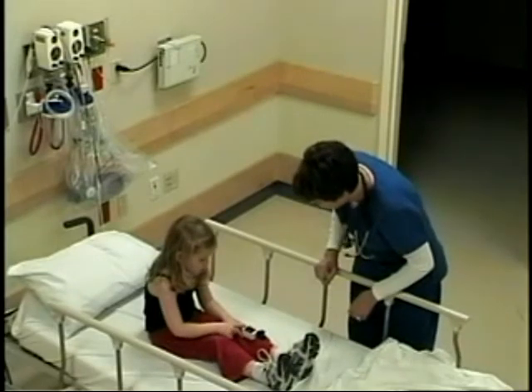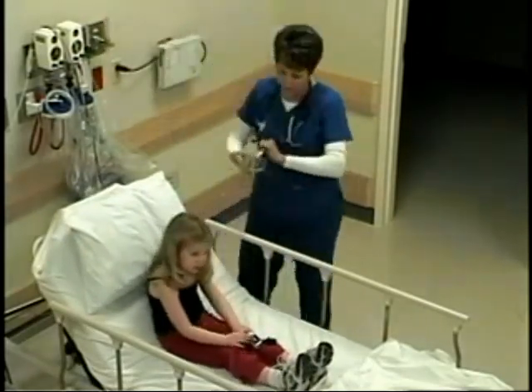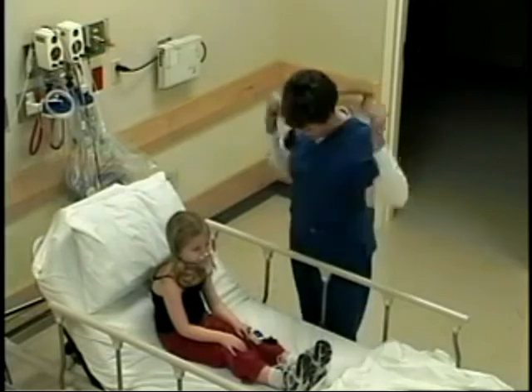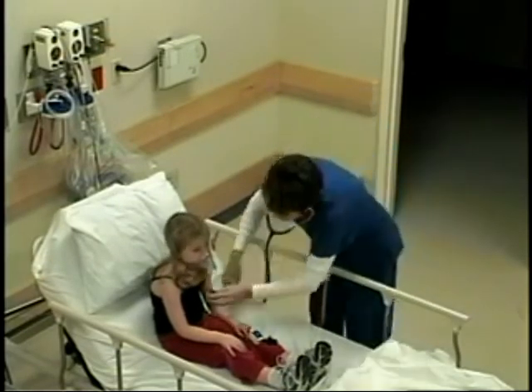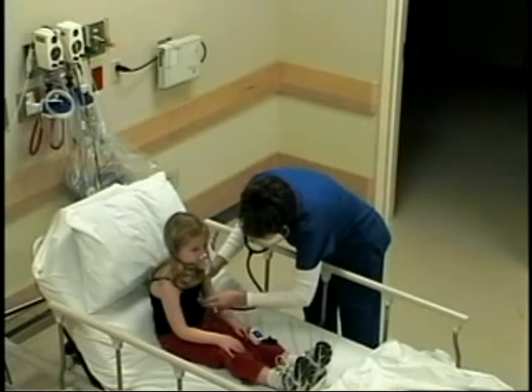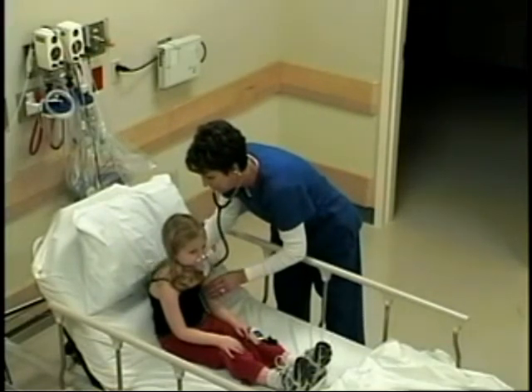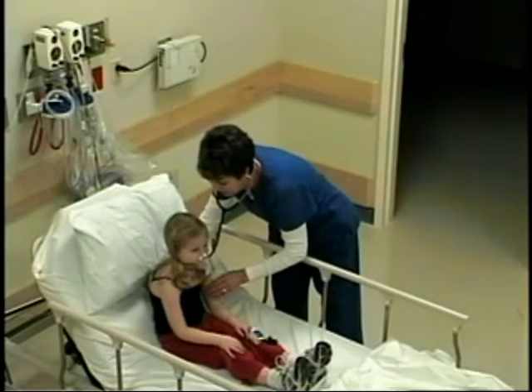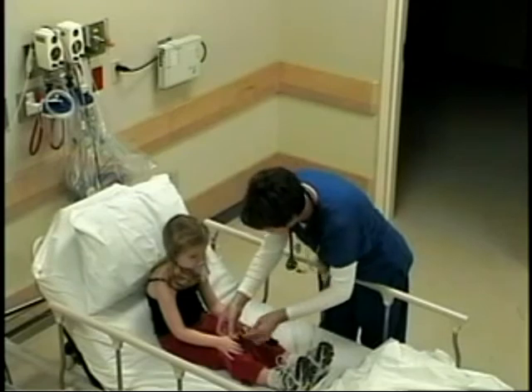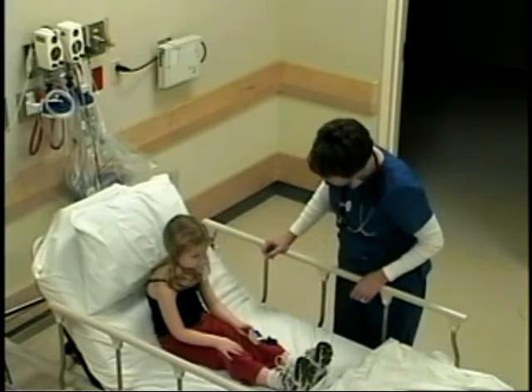Your oxygen is a little bit low, Maddie — it's only 87. I'm going to put the head of your bed up and put a mask on your face that's going to give you a little bit of oxygen to help you breathe. Let me take a listen to you. Maddie, your lungs sound a little bit wheezy, so I'm going to have the doctor come in and take a look at you. We might have to give you a little albuterol treatment — it's a mask just like this but with mist in it, and it will help you breathe better and get rid of that wheezing.